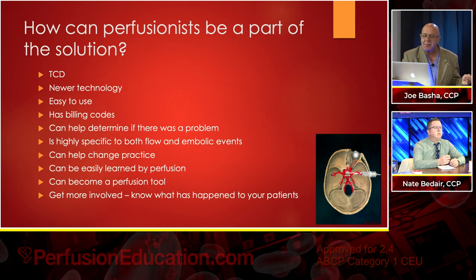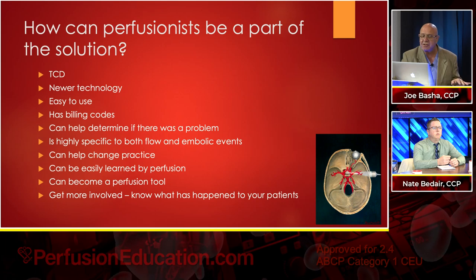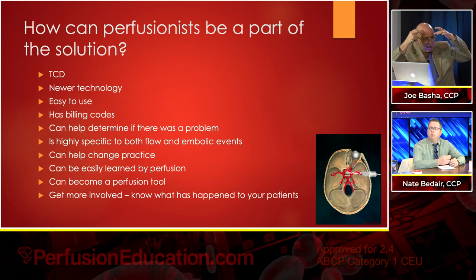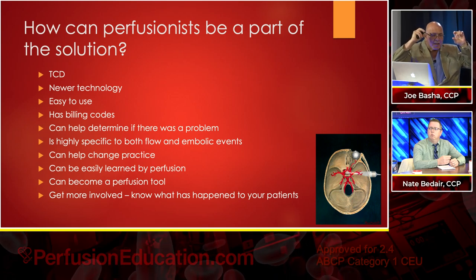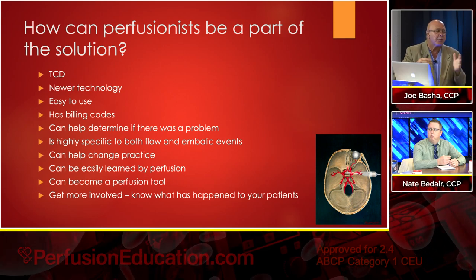How can perfusionists be a part of this solution? Well, I think TCD just makes a lot of sense. I'm going to show you there are some newer technologies, because with the old style TCD, you have to put this thing on the head and you have to sort of aim it, and it's challenging and it takes some skill and it's labor intensive.